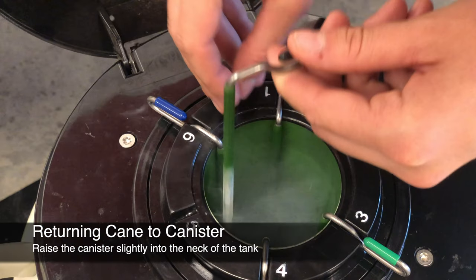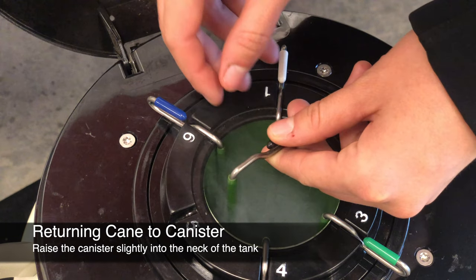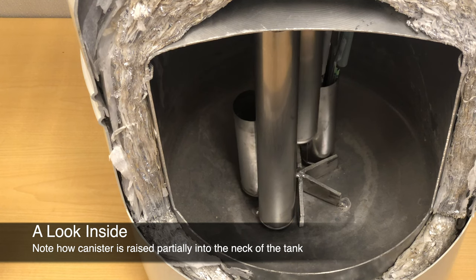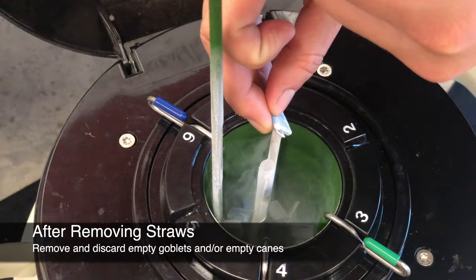After the straws are removed, raise the canister back up slightly, return the cane to the canister, and lower the canister back fully into the tank. In order to avoid losing canes within the tank, make sure the canister is raised partially into the neck of the tank before releasing the cane. The canister and tops of the other canes should not be raised above the frost line.